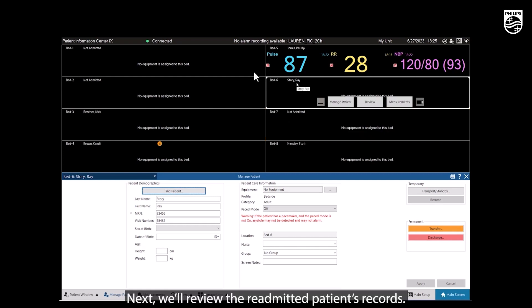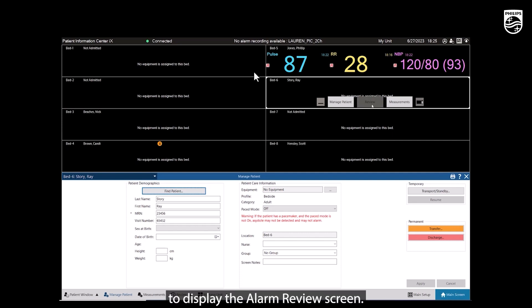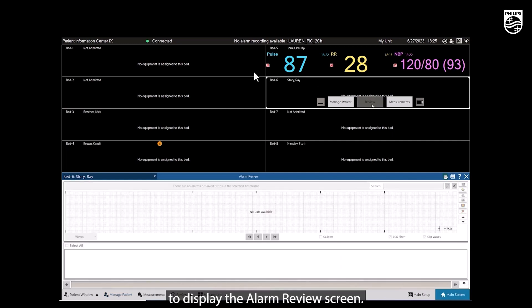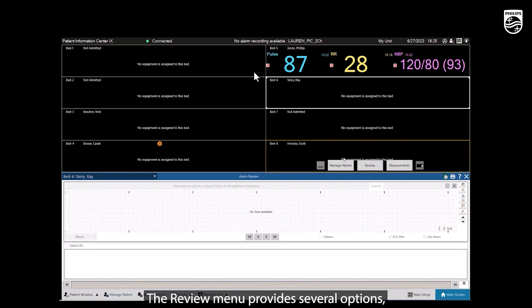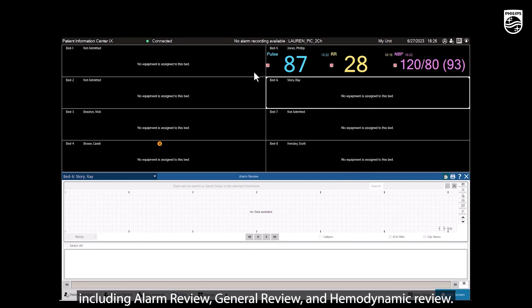Next, we'll review the readmitted patient's records. Select Review to display the Alarm Review screen. The Review menu provides several options, including Alarm Review, General Review, and Hemodynamic Review.